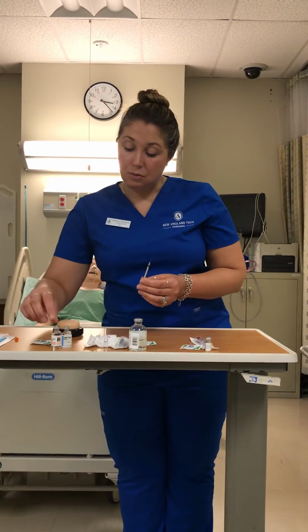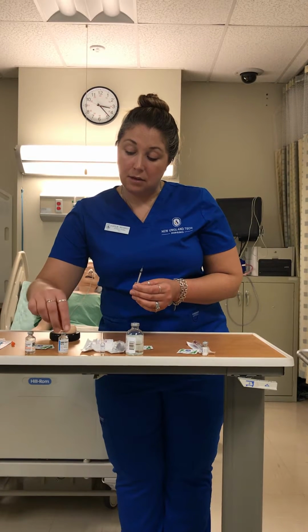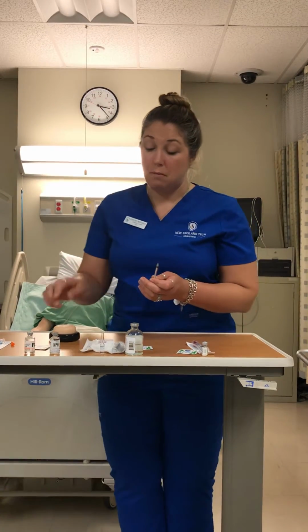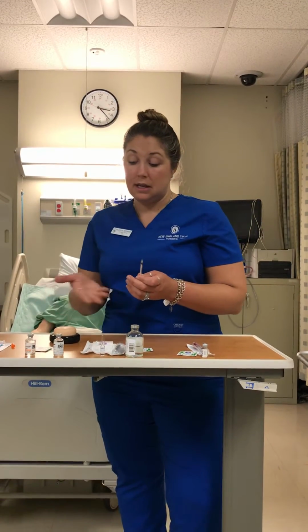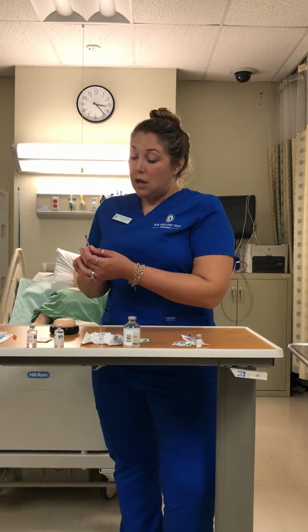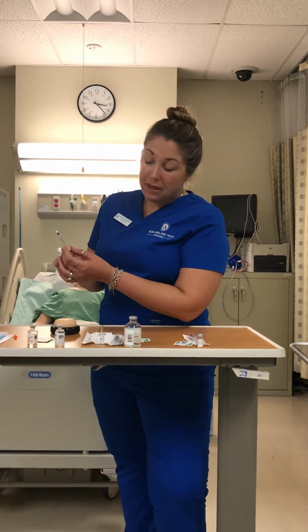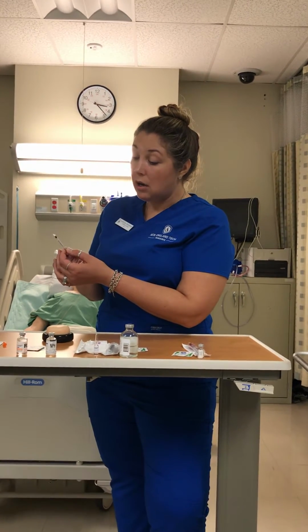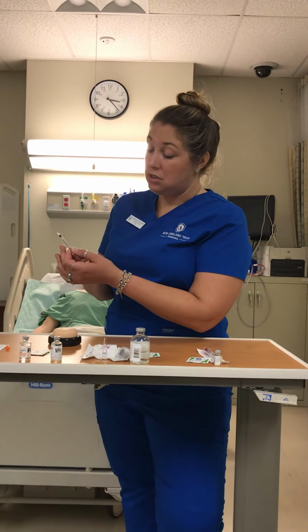Now for this medication, we have the fast-acting insulin, and then we also have the long-lasting insulin. You want to make sure you roll those medications in your hand to mix the long-lasting, because there's sediment at the bottom, and that's part of the medication. To draw up insulin, or any kind of medication that's in a vial, you want to make sure that you check to see how much insulin they need.